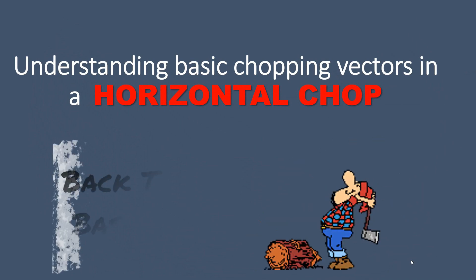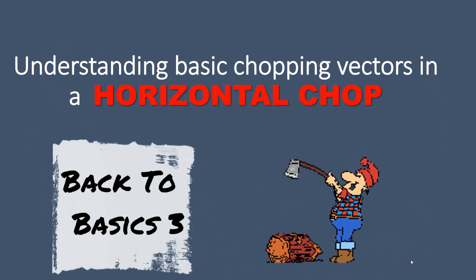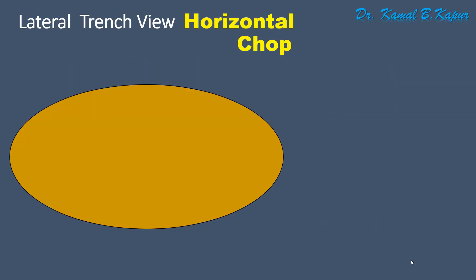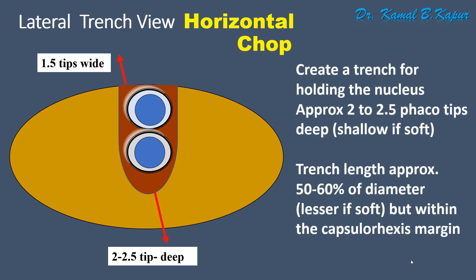Welcome to this new session of Back to Basics, where we will be mastering how to perform a horizontal chop. A horizontal chop is different from a vertical chop. Looking at the lateral view, we make a slightly deeper trench than the vertical chop — at least 2 to 2.5 FACO tips deep — and a slightly wider trench to allow for the FACO sleeve to be accommodated.